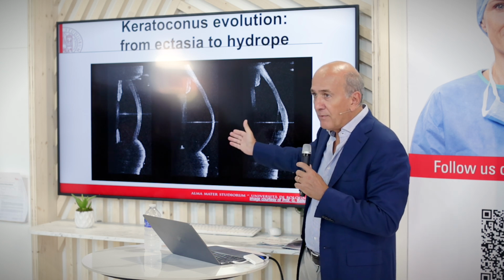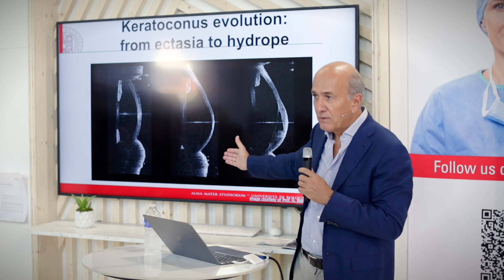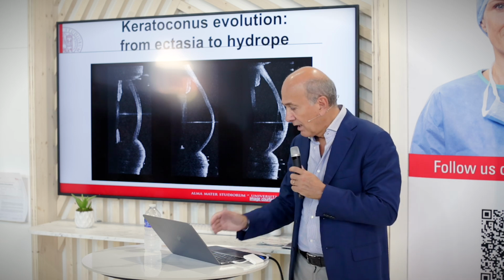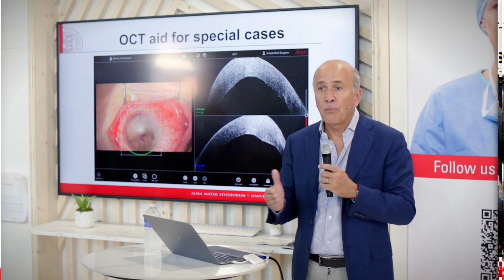You of course know about hydrops. This is a keratoconus evolution, and at a certain stage, some patients may develop a hydrops. And I'm presenting you the treatment of a case of corneal hydrops in a keratoconus patient that we did not want to operate by doing a keratoplasty.